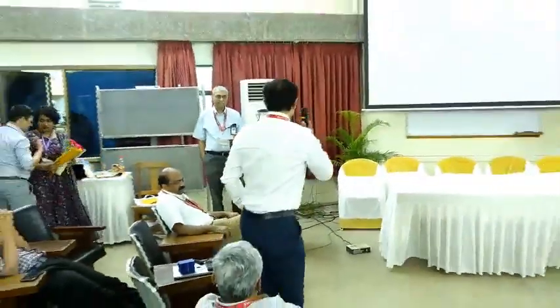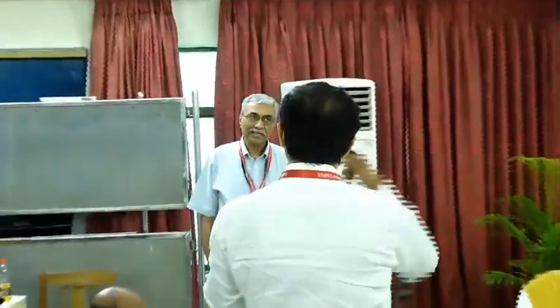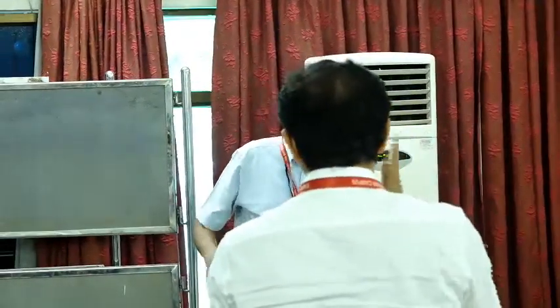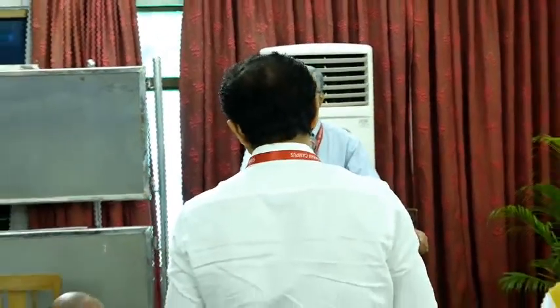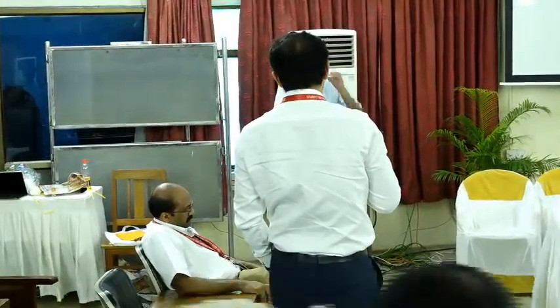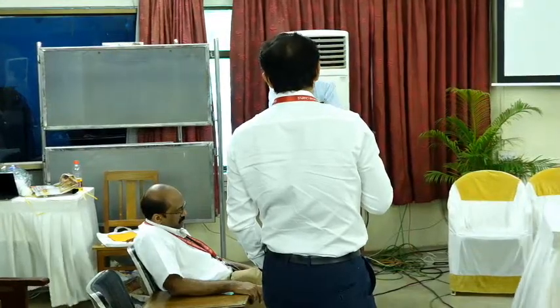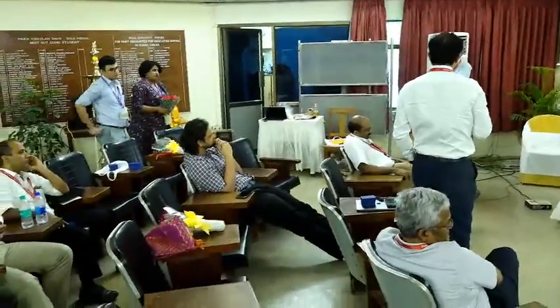Sir, that's very nice. I've seen this presentation many times from you. How do you keep the mortise in the body? How do you make the mortise? Do you create another dent in the body for it to fit correctly? Yeah, absolutely. You can angulate your drill. I typically took a 4 millimeter drill, and you just angulate it. The drill bit gives you an idea of the depth because it's 4 millimeters. So you go till you stop seeing the bit itself. Similarly, you go down and do that.